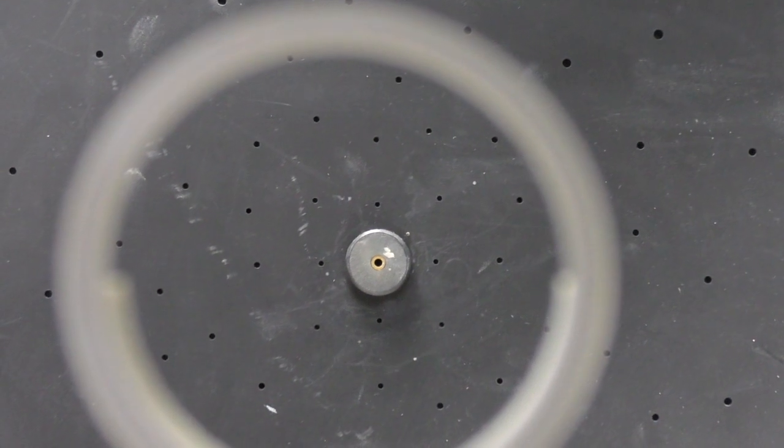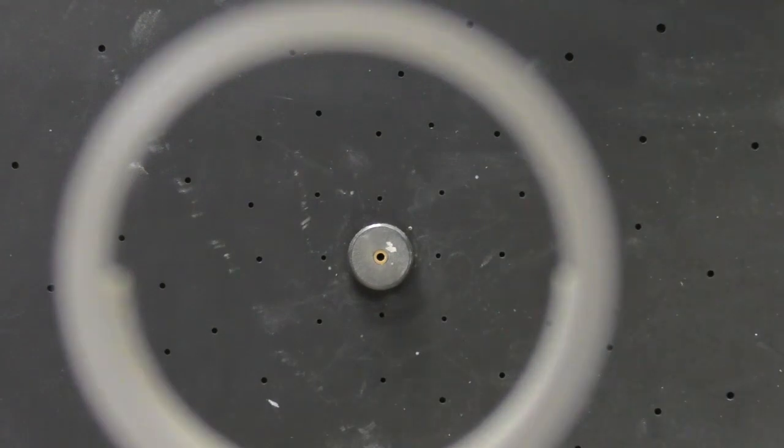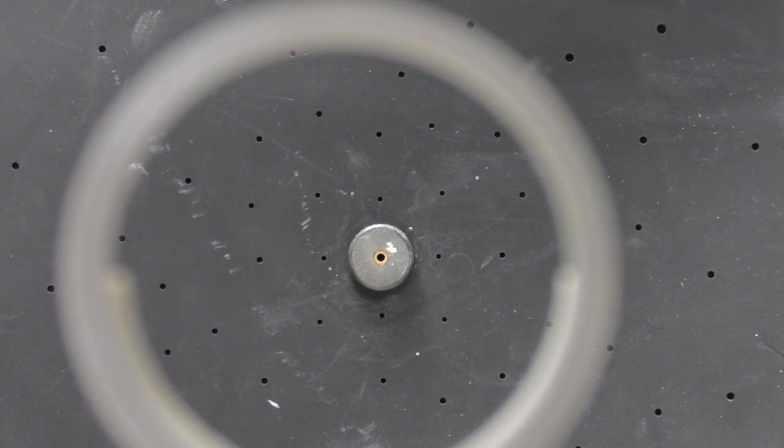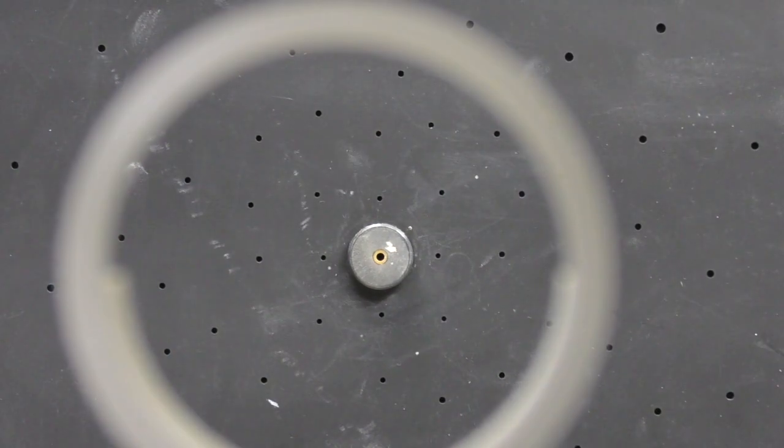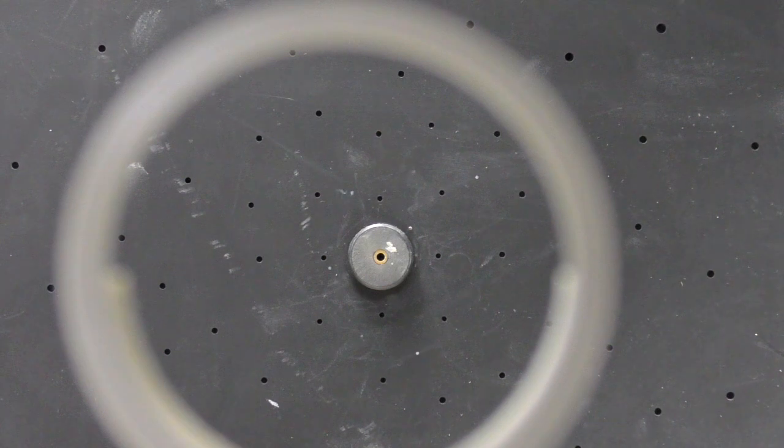So in this case, we can see there's three lights. And we can just go to a different setting and have different sets of lights showing up. These are fairly dim. And as you'll see later, there's filters to control the intensity and colour of these.